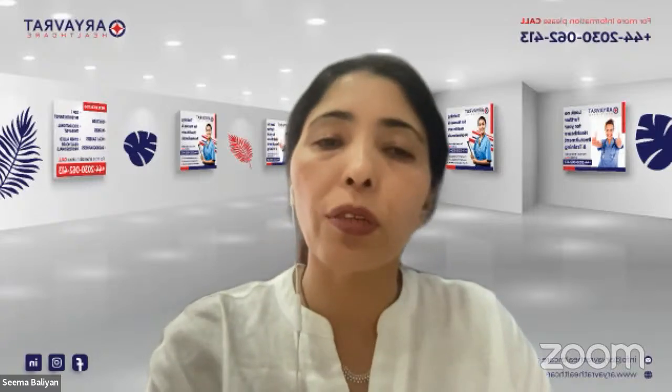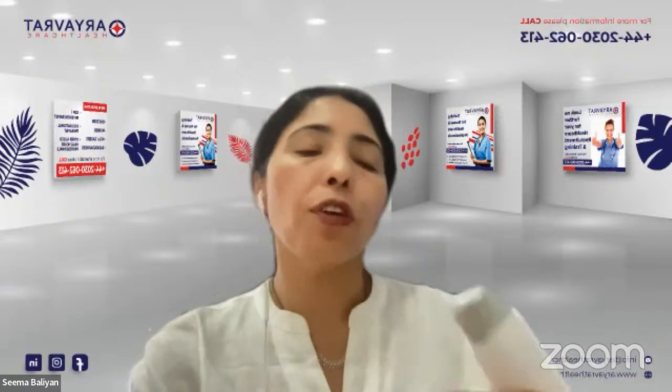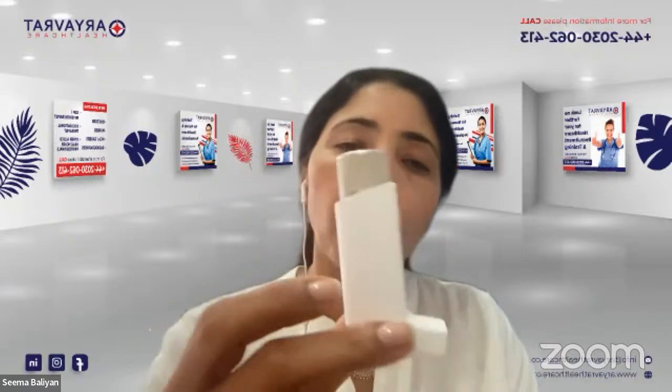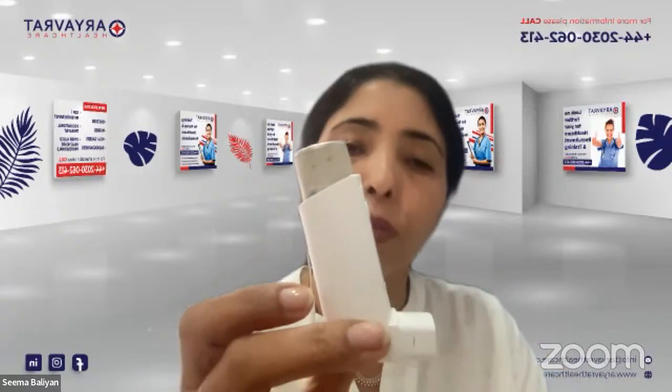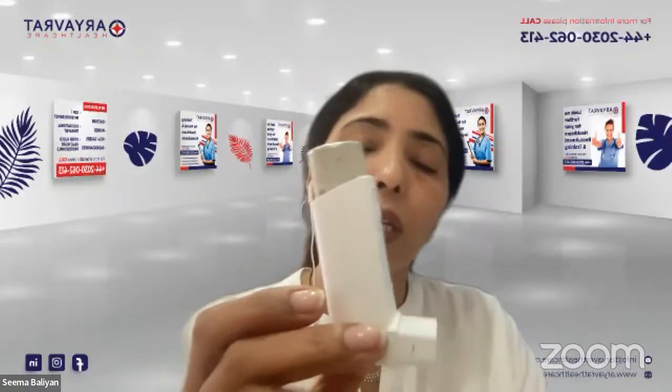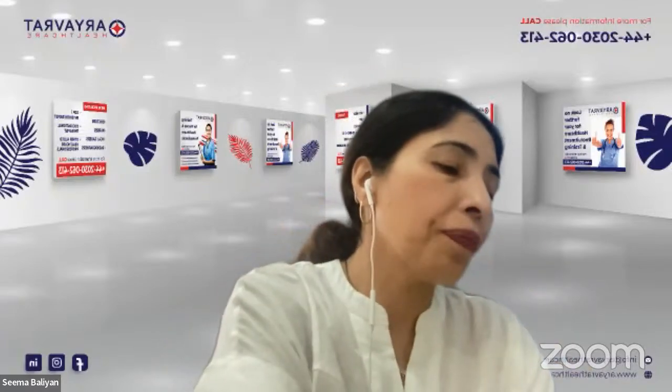Then you are also going to tell the patient that now we are just briefly going to discuss the maintenance of this device. If you are using directly from the inhaler, then make sure that you clean the mouthpiece before and after use. You can just use the cleaning wipes and let it dry for 30 seconds.